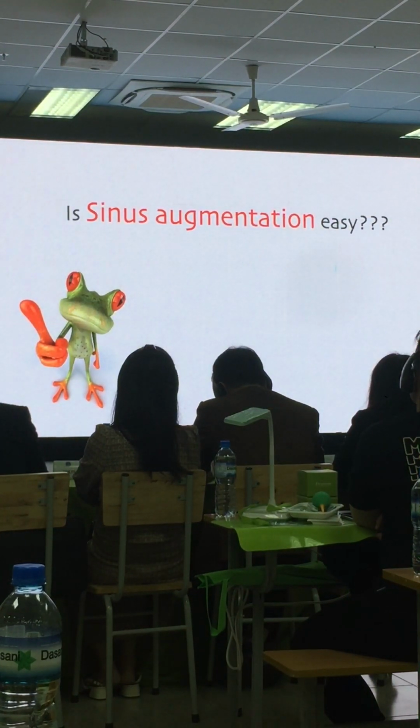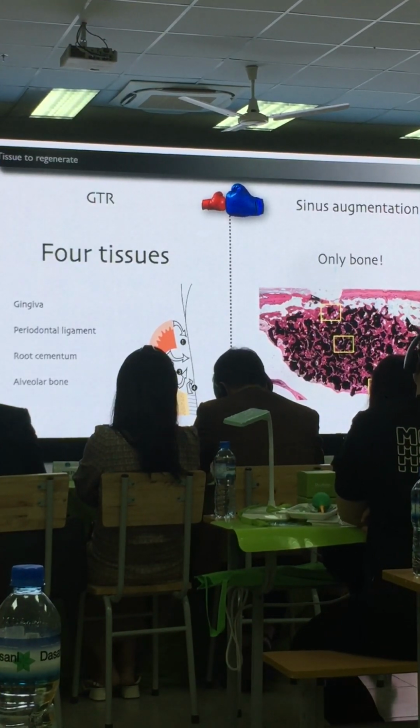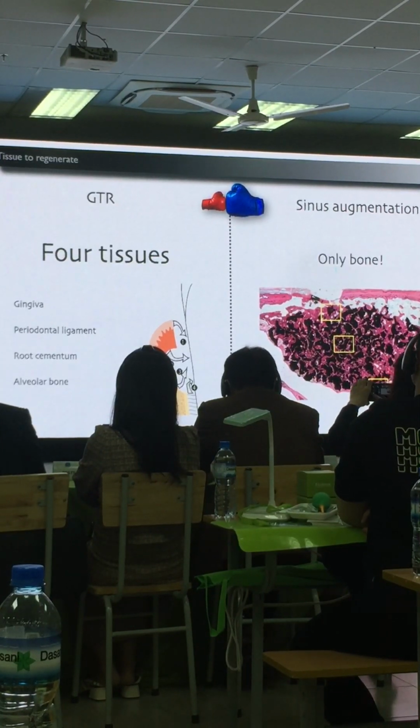I always say to my colleagues that sinus augmentation is rather easy. You may say, what? Let me explain about it. First, I will compare the sinus augmentation procedure with the guided tissue regeneration procedure, which is performed for periodontal regeneration.